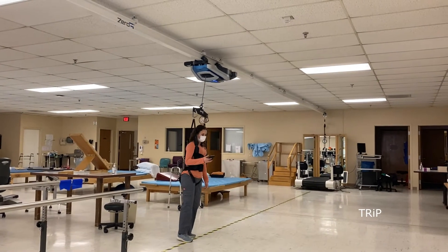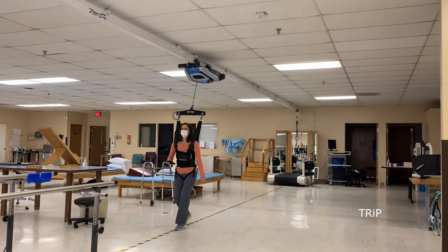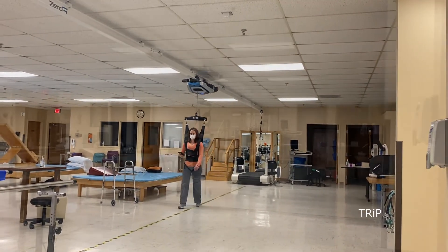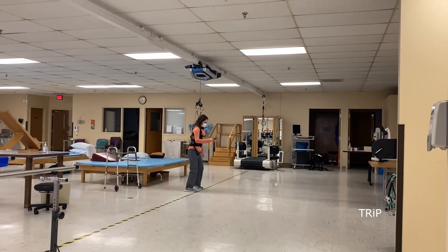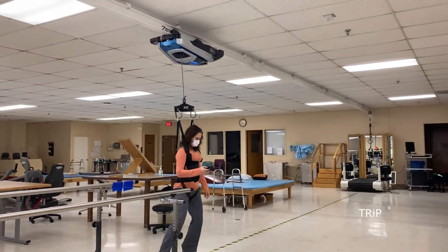Trip is a training module that applies perturbations to help teach subjects how to recover from a loss of balance. The perturbations can be applied while stationary or during walking over ground. The strength and direction of the perturbations can be varied to challenge the subject.